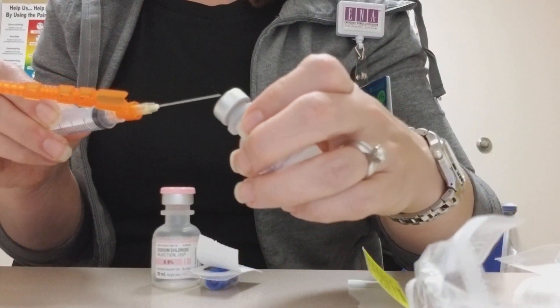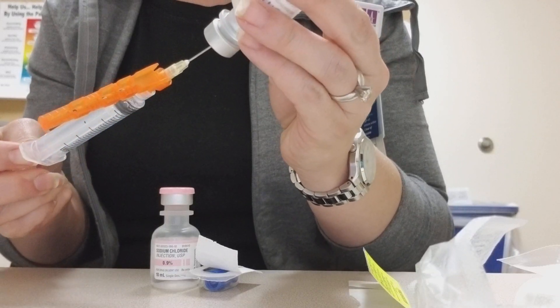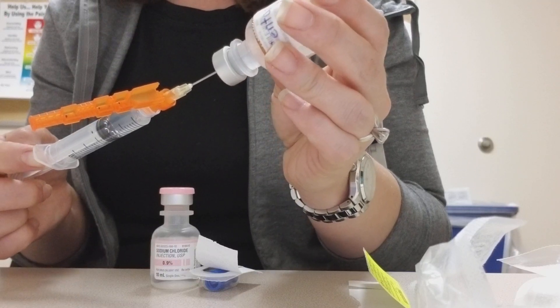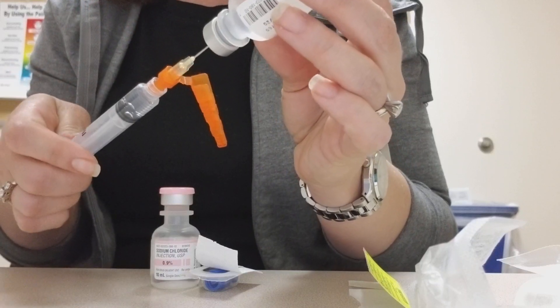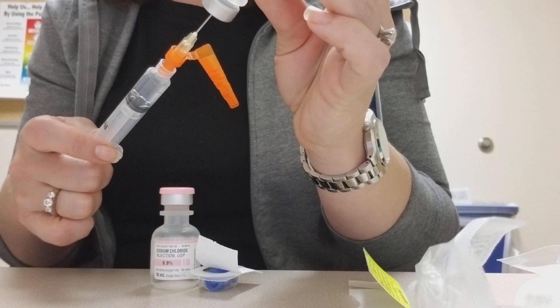Then we can draw up our medication. This is a nice and easy way that we can pull up either the whole medication, or we can waste more simply and clearly if that's called for. So let's say we're drawing up 100 micrograms of fentanyl — that will be two mls.